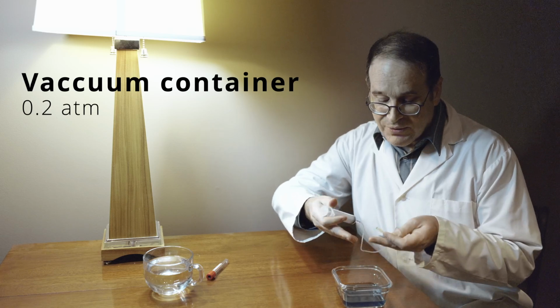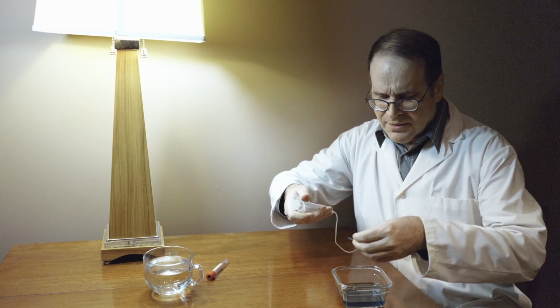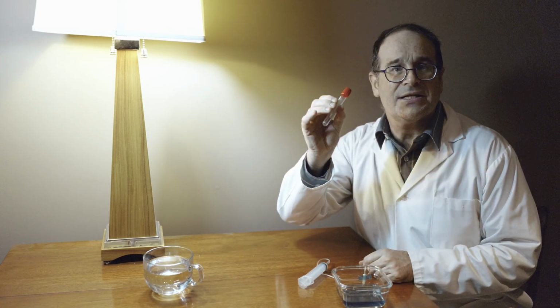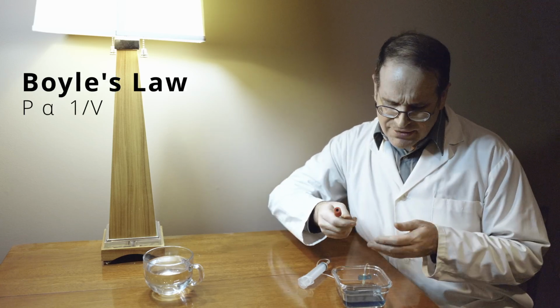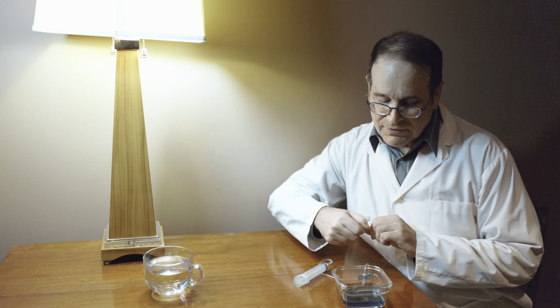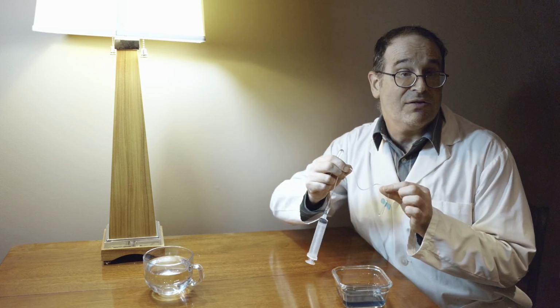This means that everything we need to explain is entirely in water. We don't need to invoke the cellular components of blood, nor any enzymes or proteins. So what can be going on? Well, when you have a vacuum collection device, it has a pressure of approximately 0.2 atmospheres. As fluid is incompressible, that means when you apply the vacuum tube to the end of the butterfly needle, the entire length of the tubing will drop to 0.2 atmospheres initially.